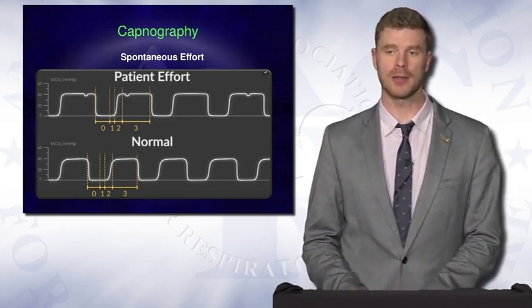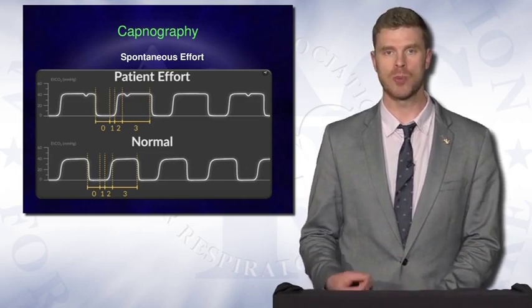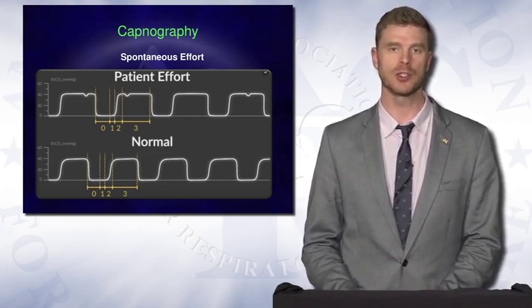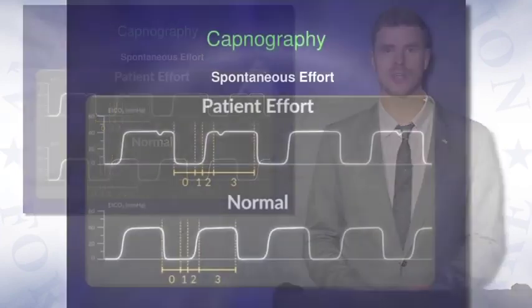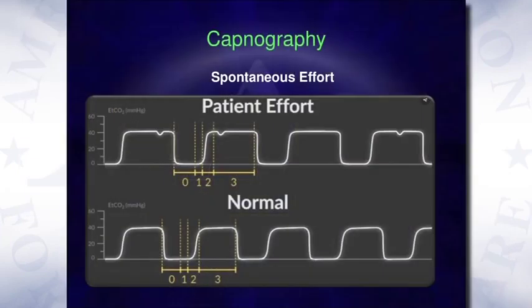What this can indicate is a transient or small inspiration by your patient. This can be due to asynchrony or inappropriately set ventilator settings, namely trigger sensitivity. Or it could be a product of discontinuing a neuromuscular blockade, in which case the patient is attempting to take a spontaneous effort, but unable to do so completely and fully.